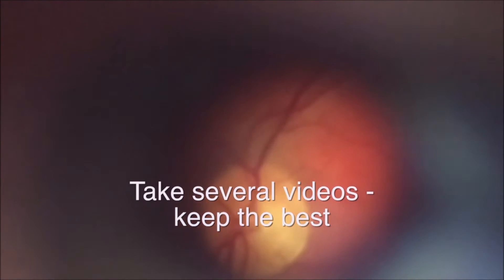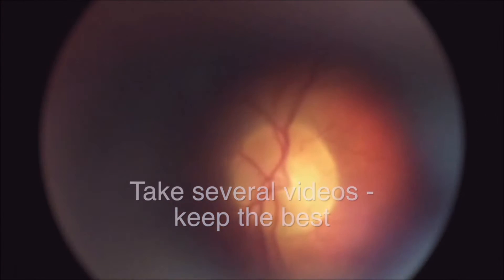Upon conducting an exam, it is best to take 30-second videos so the file does not become too big. Take several videos, save the ones you want, and discard the rest.